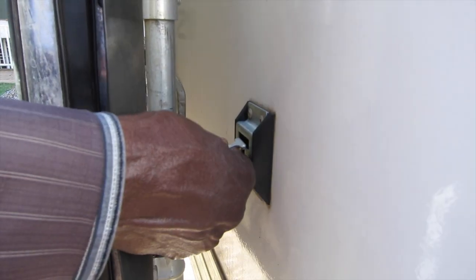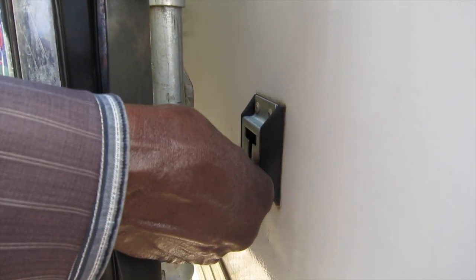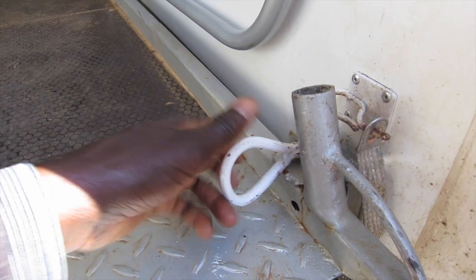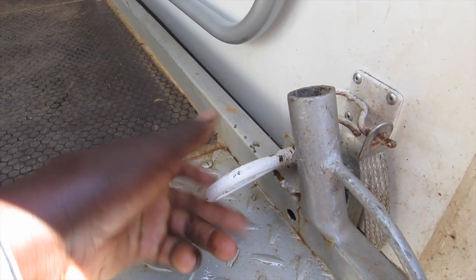Next, open the door and secure the latch along the side of the truck. After the door is secure, release the retaining bolt from the ramp and place it into the holder as shown.